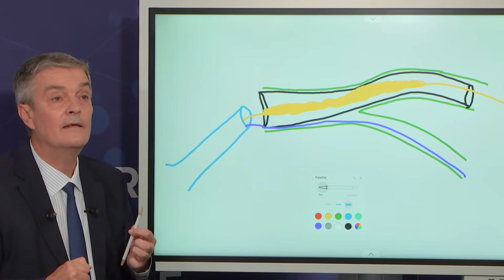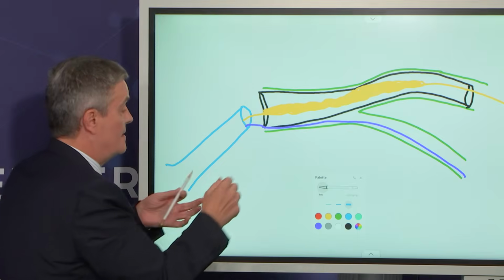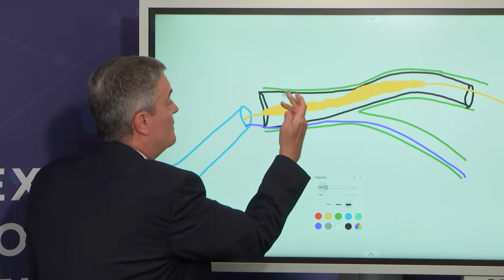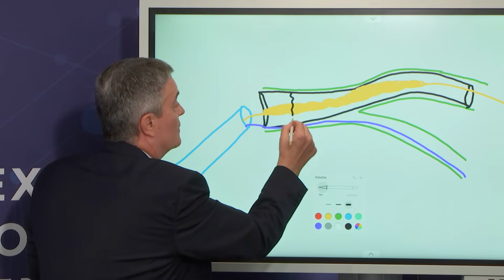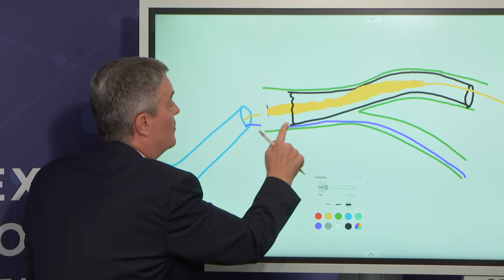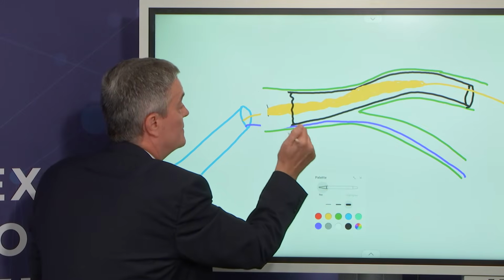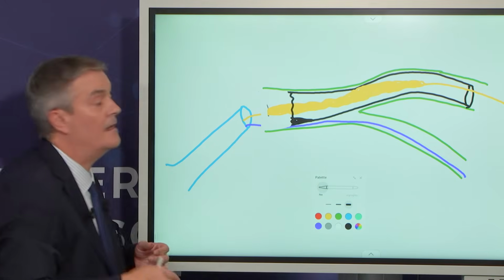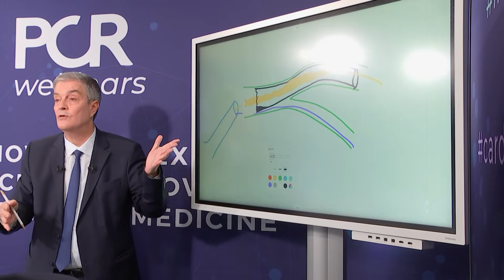As a result, as you see in the image, you now have stent deformation. The stent is not present anymore at the ostium, plus with the guiding catheter contact, you actually create damage and deformation of the stent.